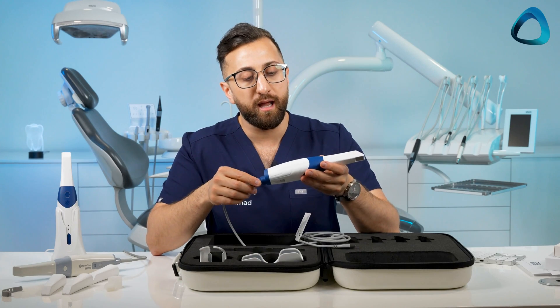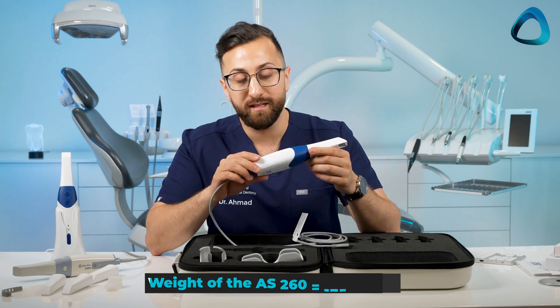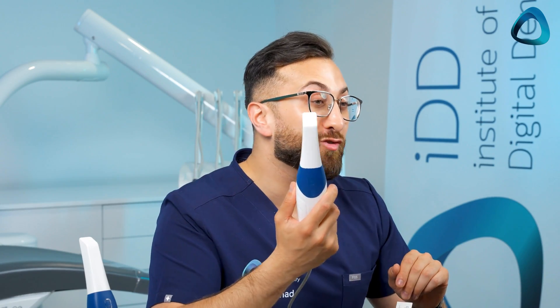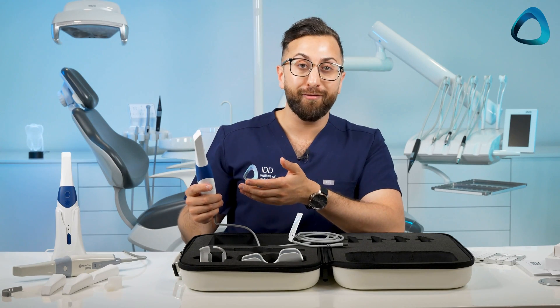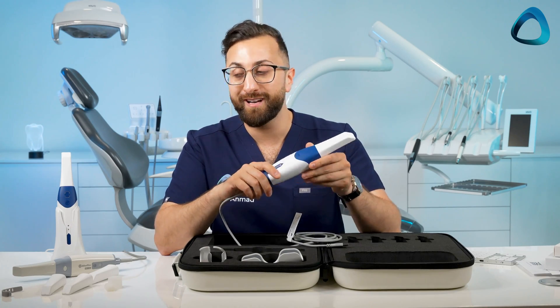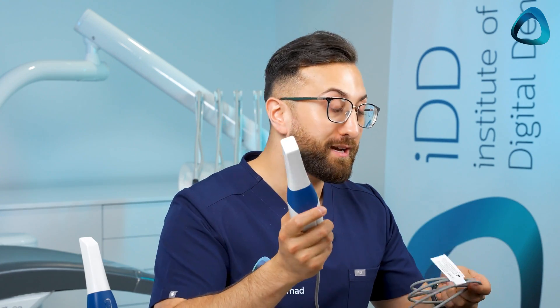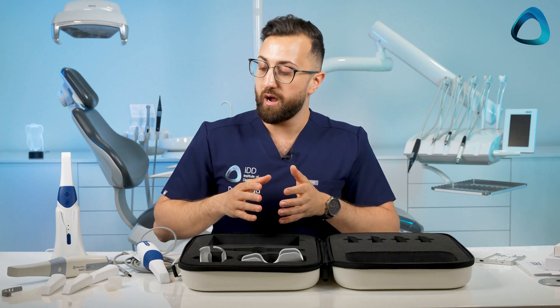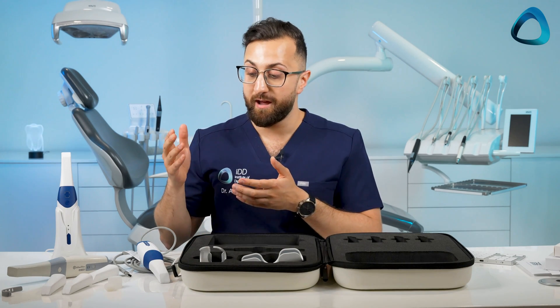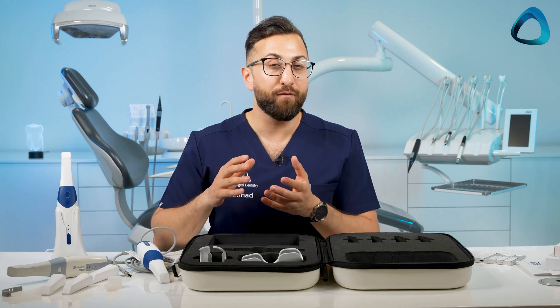The scanner also seems quite light — I'll put the exact weight on screen. The company tells me these are drop-resistant scanners, though I'm not brave enough to test that here at the IDD studio. Lastly, there are no calibration tools in the box — this is a completely calibration-free scanner. That's really the trend with these newer lower-cost scanners: subscription-free and no calibration required.